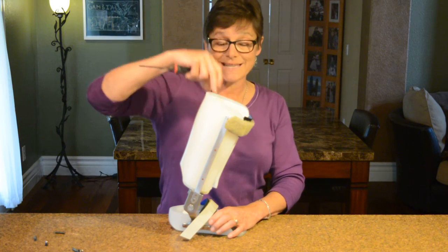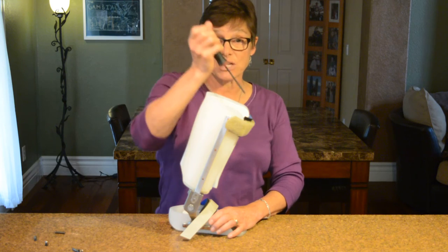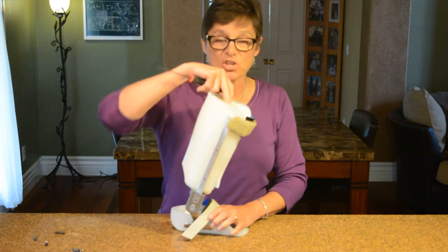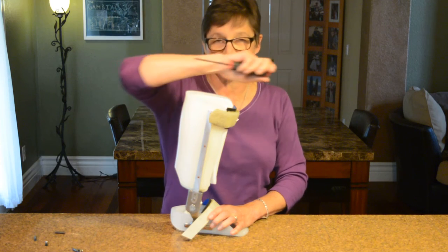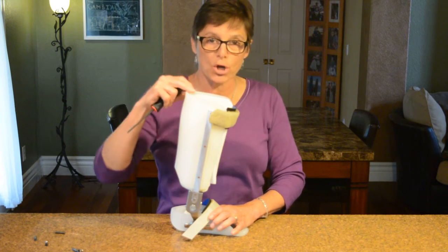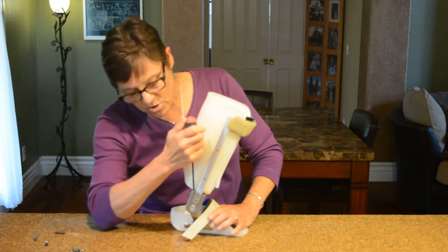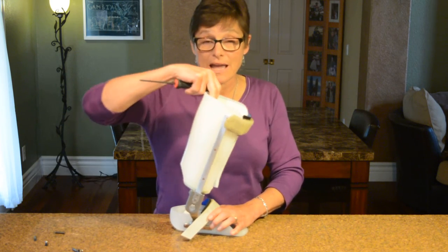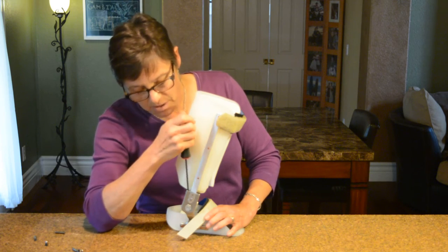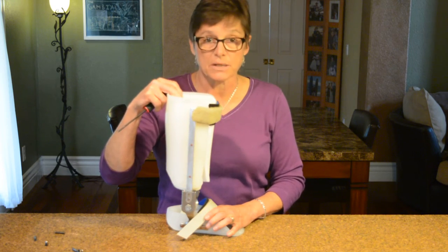As I open up the anterior channel, the brace now allows the patient to go into dorsiflexion, which further up the chain causes the knee to go forward — you're going to see knee flexion with this position. Conversely, if I don't want a patient to thrust backwards, I can slow that by not allowing the tibia to snap back — by keeping them in more dorsiflexion. By locking down the posterior channel, I can put somebody in a lot of dorsiflexion and slow an extension thrust. That's the beauty of the double adjustable ankle joint.